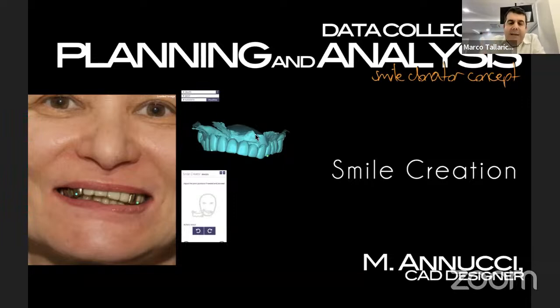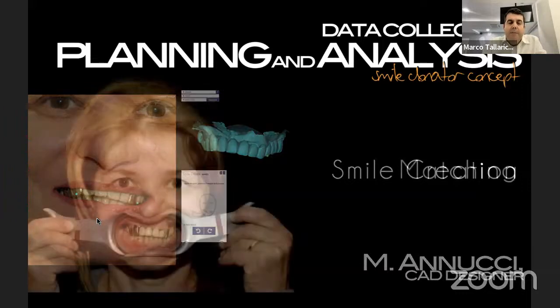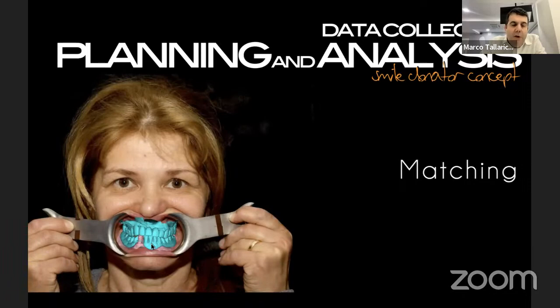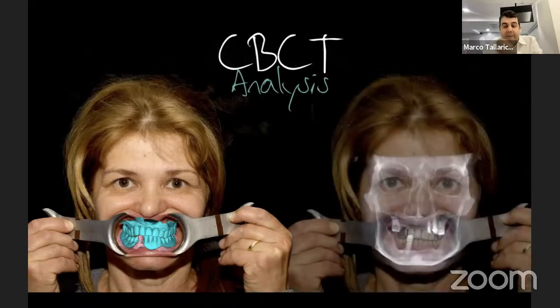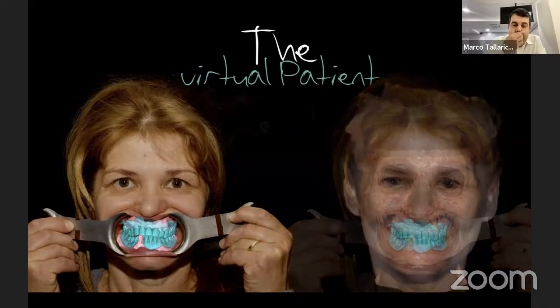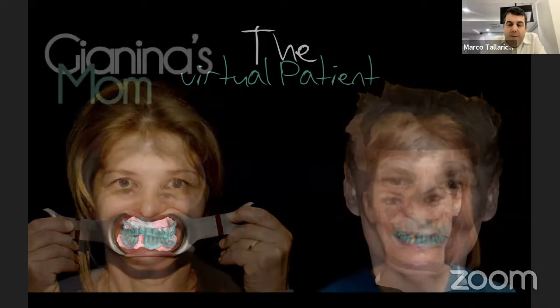Of course, starting from the impression, picture, 2 points in order to merge the data, 2 pictures with or without a retraction, as I showed you before. And also superimposition of the anatomy of both, because in this case I need to rehabilitate upper and lower jaw. DICOM file, because I need to plan my implants, and also facial scan. So I have perfectly my virtual patient, as you can see here.